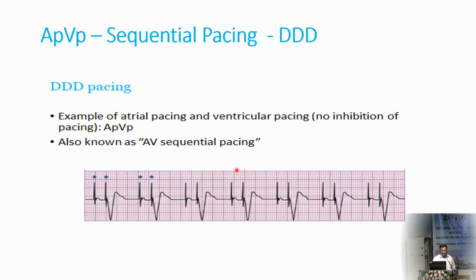Thanks, Anand. Go on. Okay, so A pace, V pace comes in where SA node and even AV node, below AV node blocks are typical. So the patient requires pacing in both nodes, as the heart rate is too low. In those scenarios, we have to give an adequate heart rate to be maintained for the patient. So A pace to V pace.